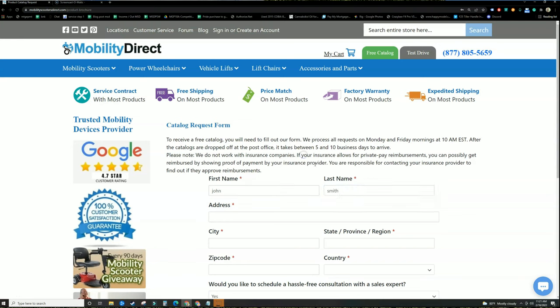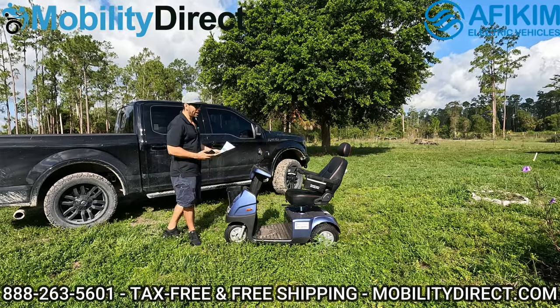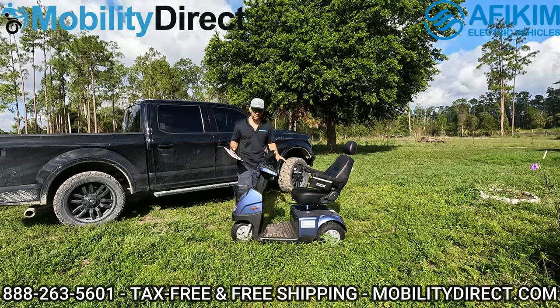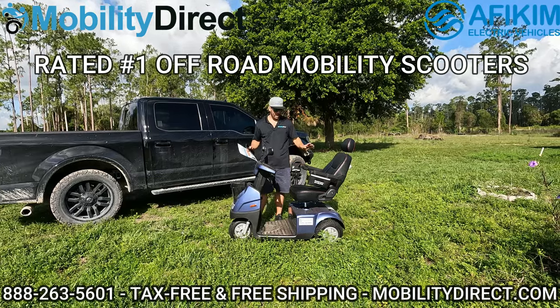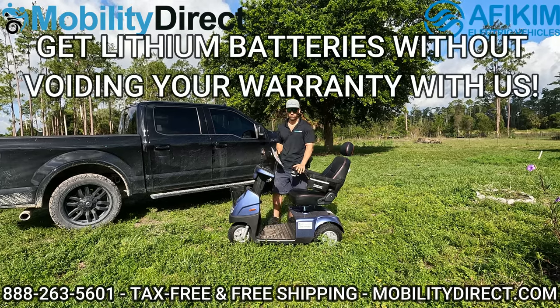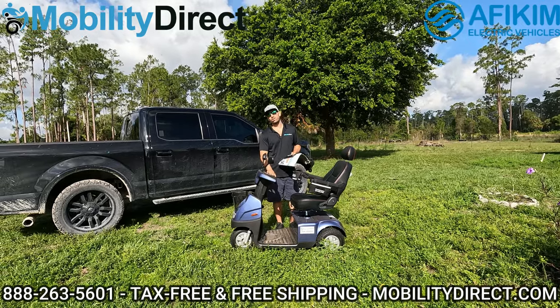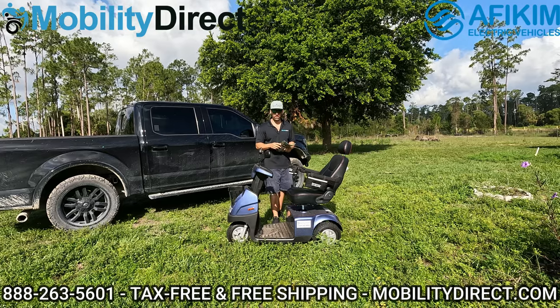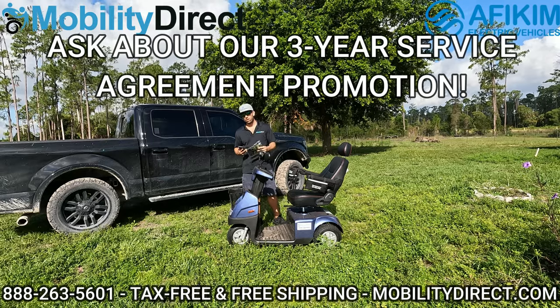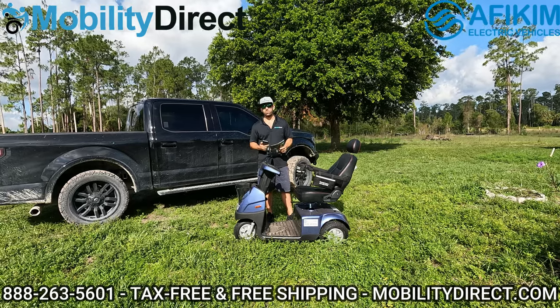With that being said, let's get started. I have the C3, which is the compact version of the Afa Scooter made by Afikim. Afikim makes the best all-terrain electric mobility scooters on the market, and we are the only company to offer exclusive upgrades such as a lithium battery upgrade, which can make this model go over 40 miles on a single charge.